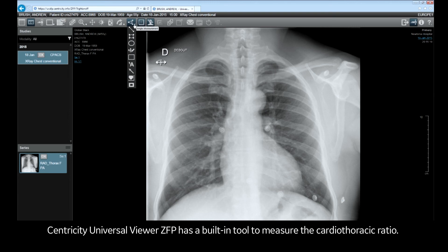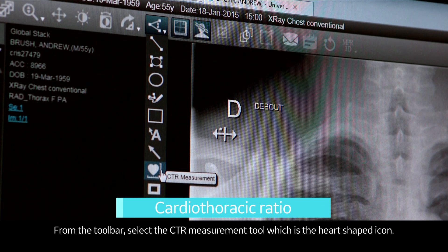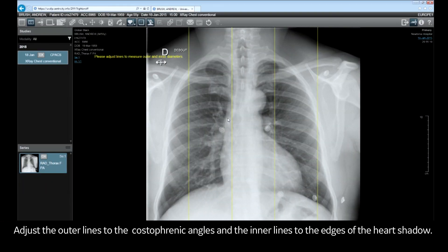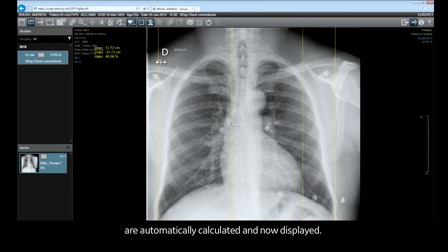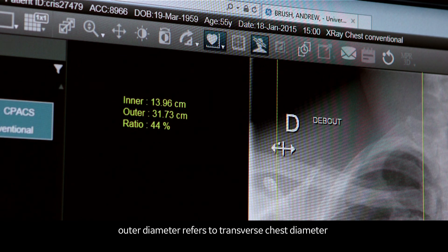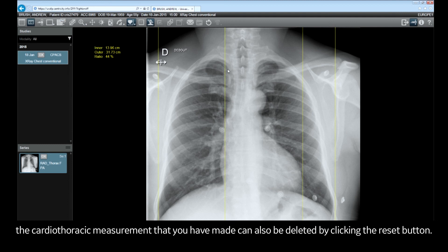Centricity Universal Viewer ZFP has a built-in tool to measure the cardiothoracic ratio. From the toolbar, select the CTR measurement tool, which is the heart-shaped icon. Just click on the image and four vertical lines will appear. Adjust the outer lines to the costophrenic angles and the inner lines to the edges of the heart shadow. The inner diameter, outer diameter, and the cardiothoracic ratio are automatically calculated and displayed. Inner diameter refers to the transverse heart diameter; outer diameter refers to the transverse chest diameter. The cardiothoracic measurement can also be deleted by clicking the reset button.